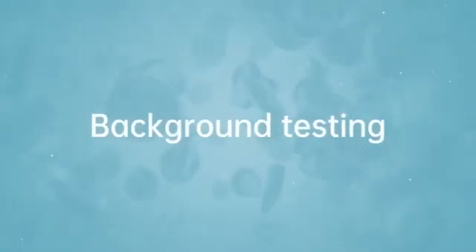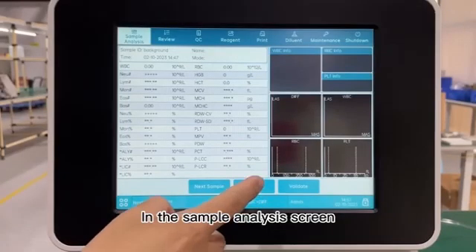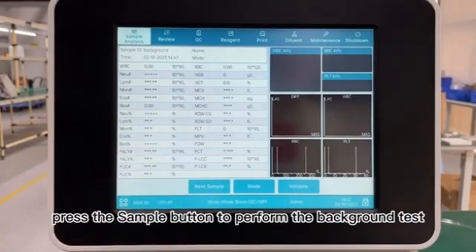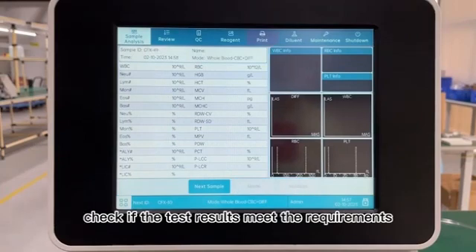23. Background Testing. 24. In the Sample Analysis screen, select Whole Blood CBC plus DIF as the mode. 25. Press the Sample button to perform the background test. Check if the test results meet the requirements.